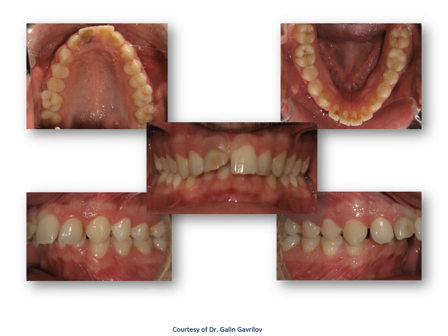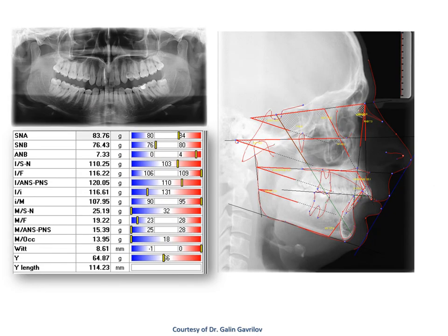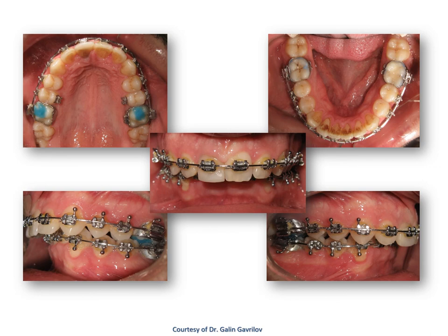This is his occlusion: increased overjet, protrusion of the upper incisors, deep overbite. The cephalometric measurements prove that he is a skeletal class 2, the ANB angle is 7.3 degrees, the Wits appraisal is 8.6 millimeters. He has a hypodivergent type of growth and protrusion of the upper and the lower incisors. These are the photographs after the decompensation of the malocclusion before the orthognathic surgery.